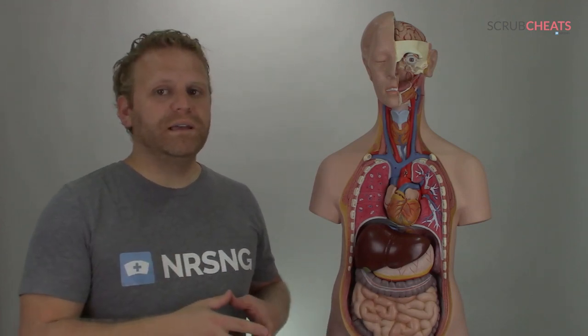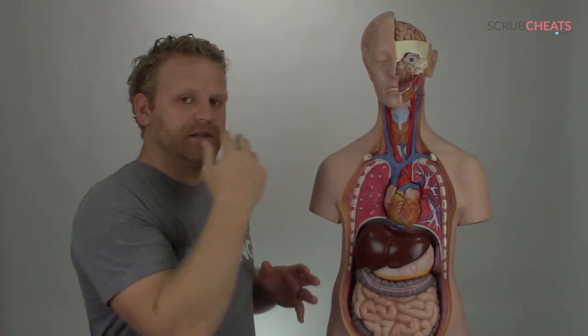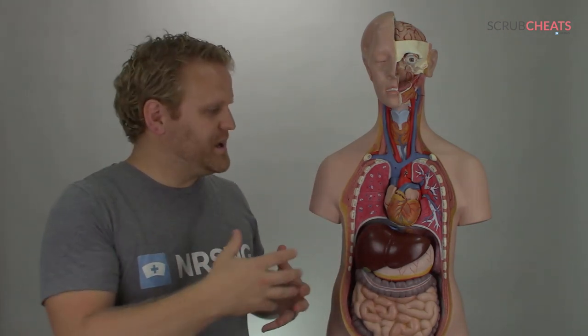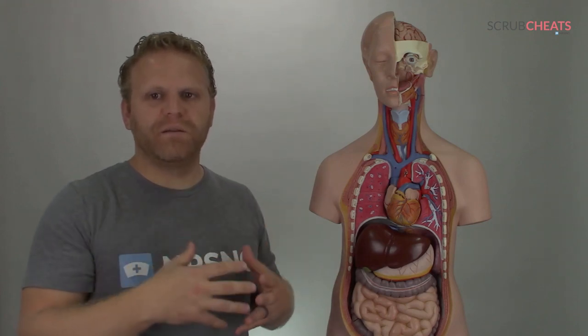The first one we all know is nasal cannula. Nasal cannula fits inside the patient's nose, just right inside their nostrils, to deliver a little extra FiO2 or percent of inspired oxygen. Like for patients who are having some chest pain or having a little bit of difficulty feeling like they can breathe.